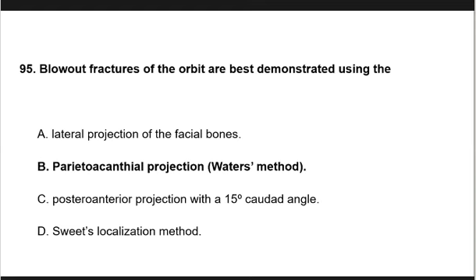That is 37 degrees, di ba? Ang normal Waters method natin, that is 37 degrees ang angle ng OML. So for the demonstration of the blowout fractures, saan makikita ang blowout fractures? In the floor of the orbit. Blowout fracture can be seen in the floor of the orbit.